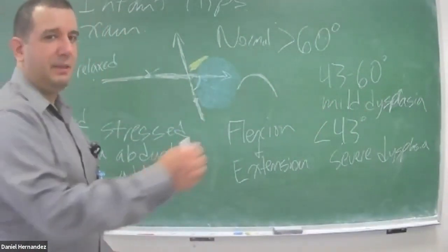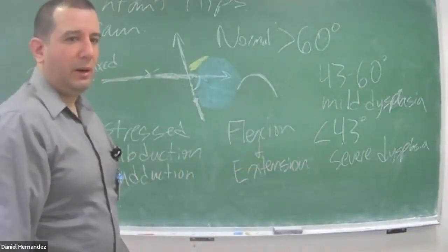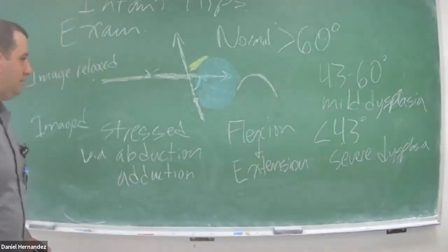Then we're going to extend the leg out and do flexion, bring the knee back in, and acquire images with flexion and extension.